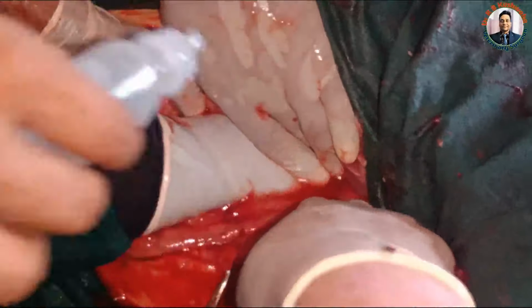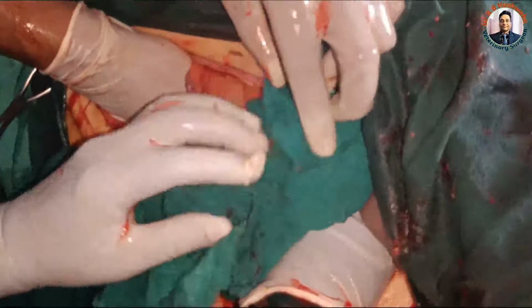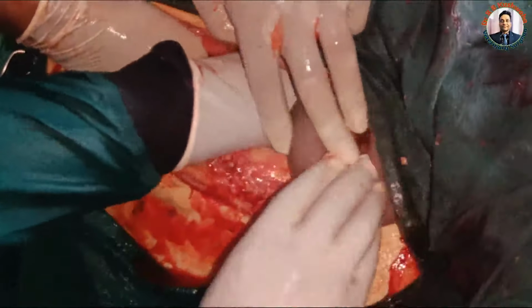But the good thing in this operation is that by putting this drape all around this uterus, we were able to prevent the contamination into the peritoneal cavity, which is the ultimate aim during the cesarean section, particularly in the infected cases.